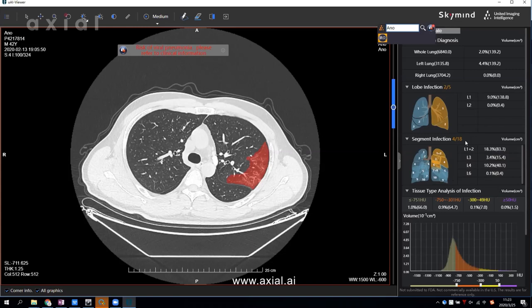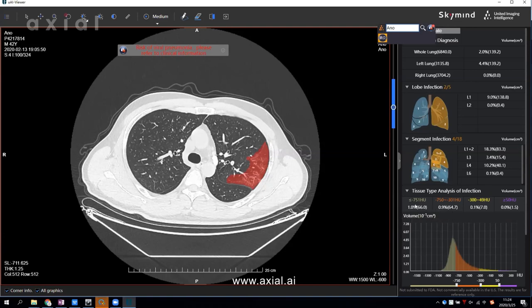Axial AI also provides intensity measurement. In this histogram, the horizontal axis is the HU value and the vertical axis is the volume. The HU range is divided into different bands, and the volume is measured at each intensity range. This value is also very important during patient follow-up.